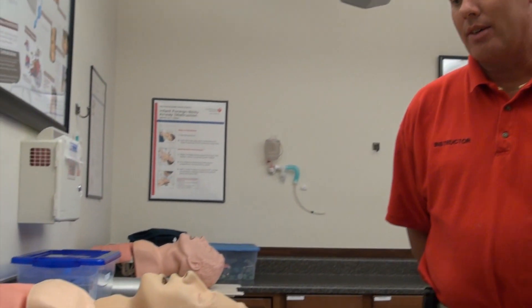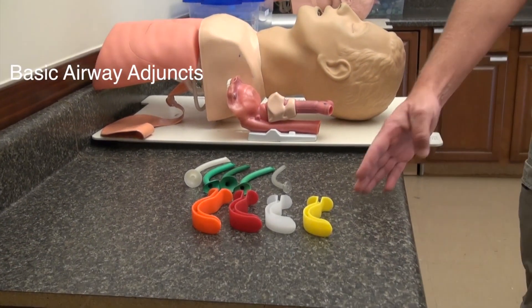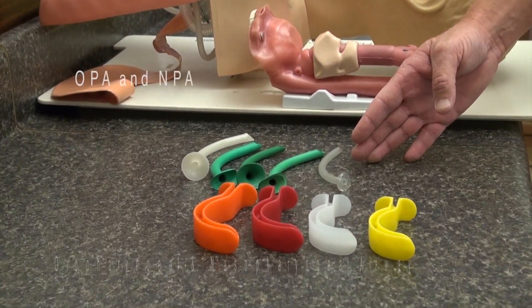My name is Mike Hislop. Today we're going to go over some basic life support adjuncts into the airway, namely the oropharyngeal and nasopharyngeal airways, appropriate sizing and placement of both.